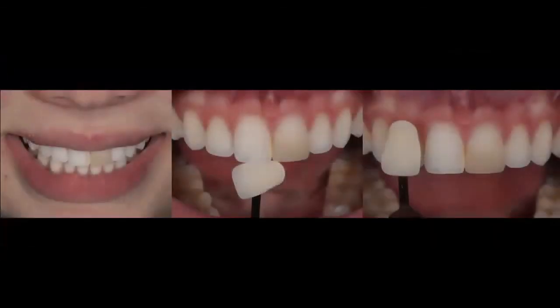Then, in order for me to be able to communicate all the halo and translucent effect, I take polarized photos. For this, you need to have a polarized filter. This is a cross polarization photo. You need a cross polarized filter made for your camera to take these photos.